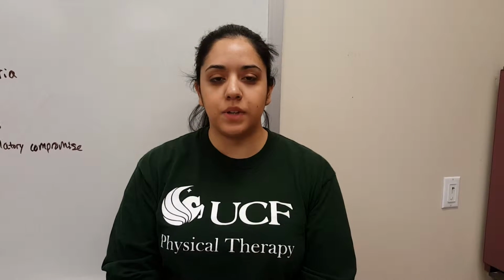Hi, I'm Talia and I'll be doing an instructional video on cryotherapy. I have chosen to treat a patient with an acute lateral ankle sprain using controlled cold compression.